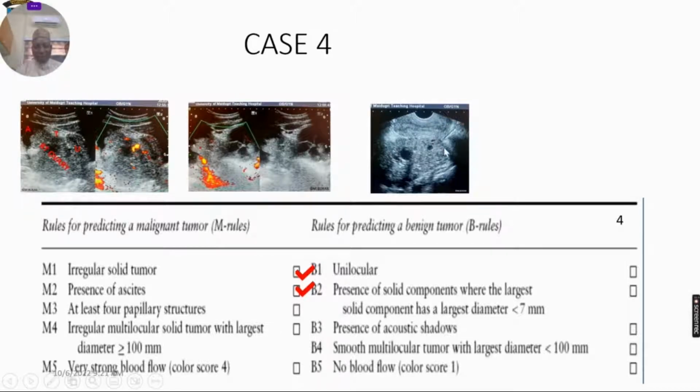Let's pay particular attention to this solid lesion on transvaginal ultrasound scan. You can see this is a solid lesion with cysts within the substance of the solid lesion. Here you can see the largest cysts casting edge shadows. These edge shadows should not be imputed as presence of acoustic shadow. Why? Because this shadowing is not coming from the substance or from the parenchyma of the lesion. It is coming from the edge of the cyst.